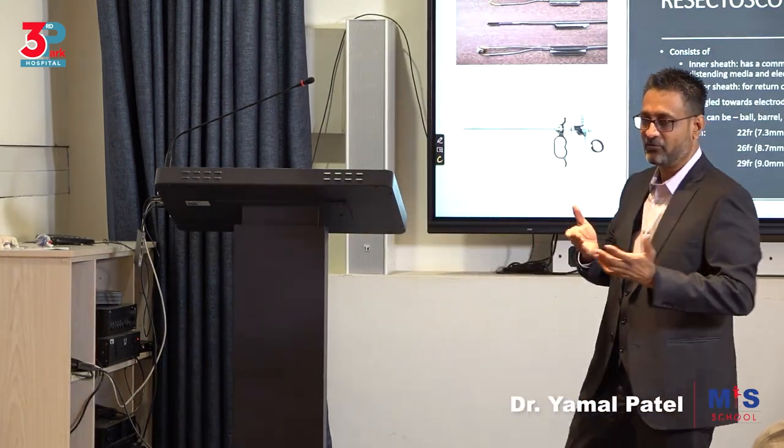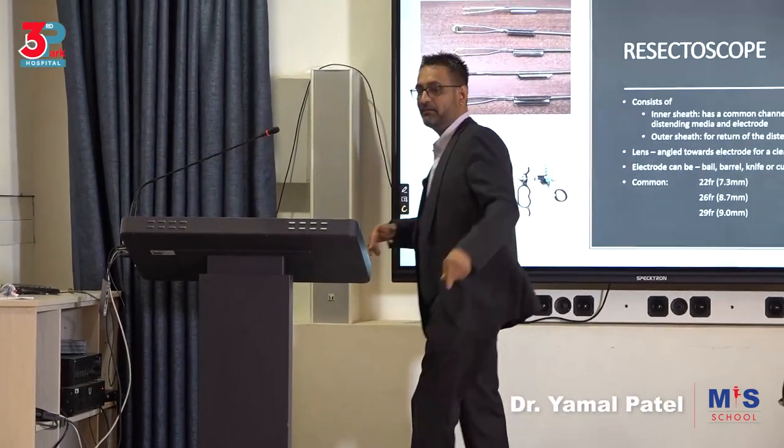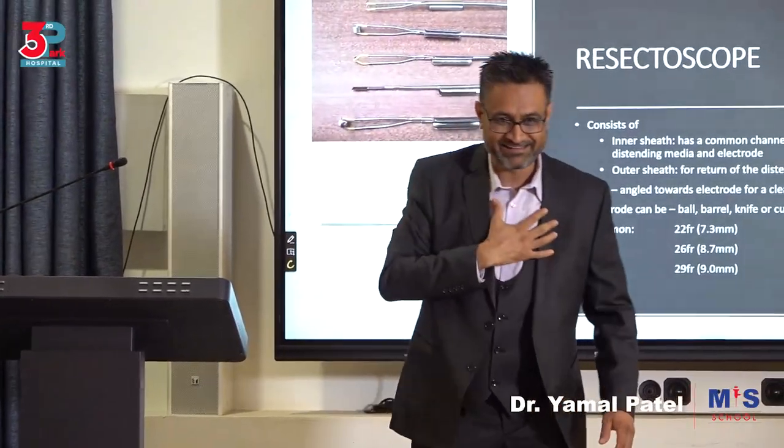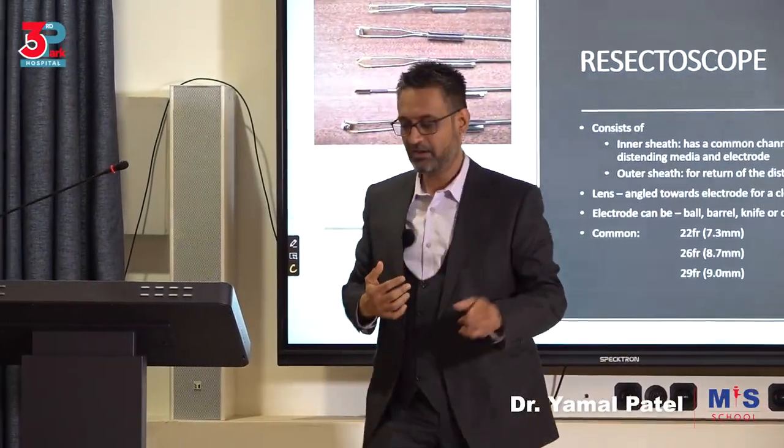You've now got the idea? So it will not work. The thing is, it will not burn. But that's the commonest answer I get. It burns the patient. Okay?